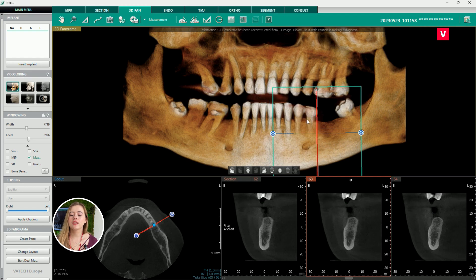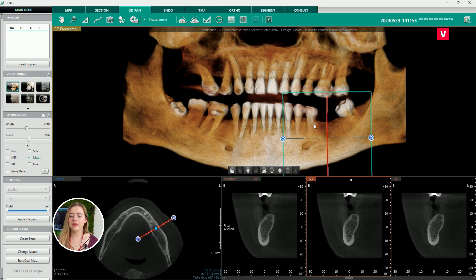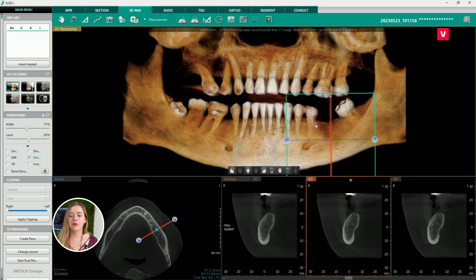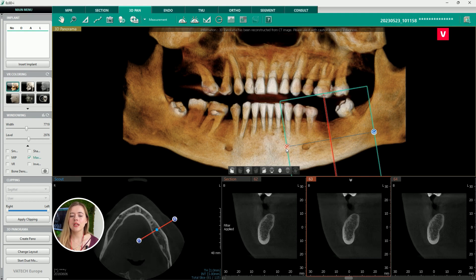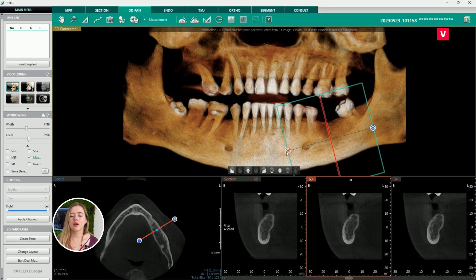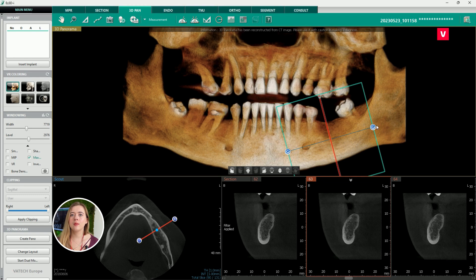The patient needed a tooth implant in place of tooth 36, and therefore a proper examination was needed to ensure that the implantation was possible and safe, and to determine the size and length of the implant. The patient was scanned by the VATIC 3D CBCT unit.